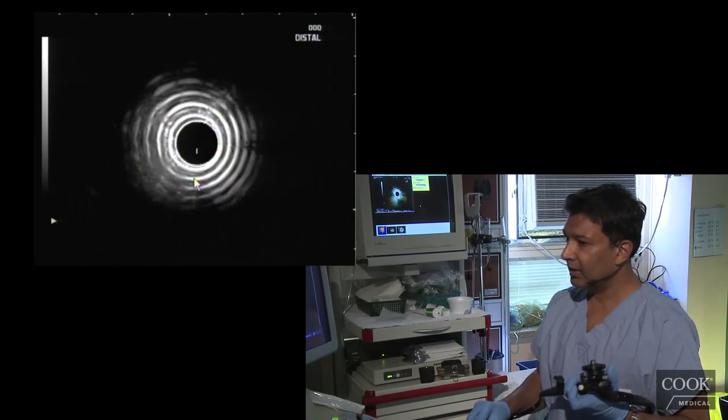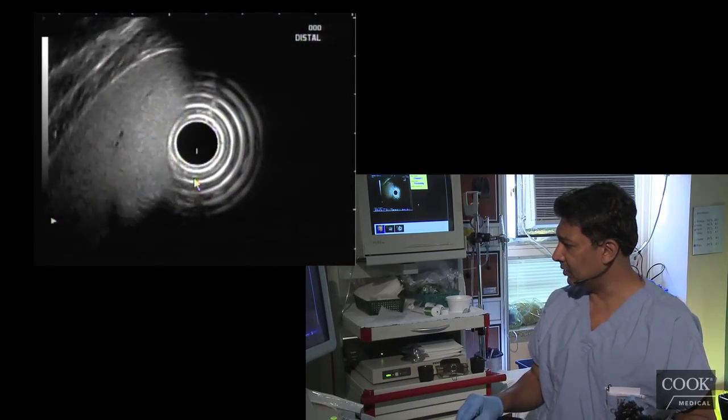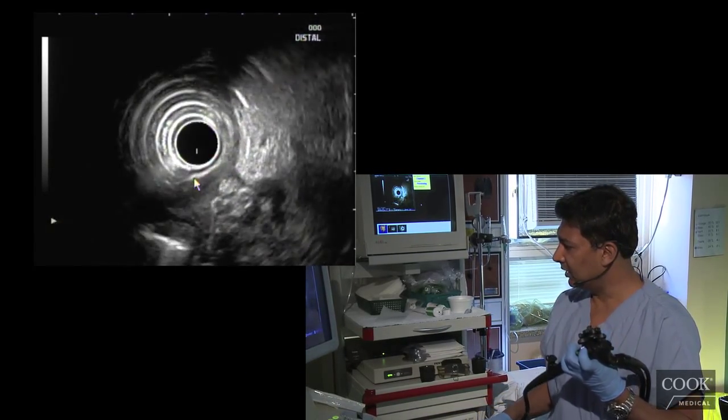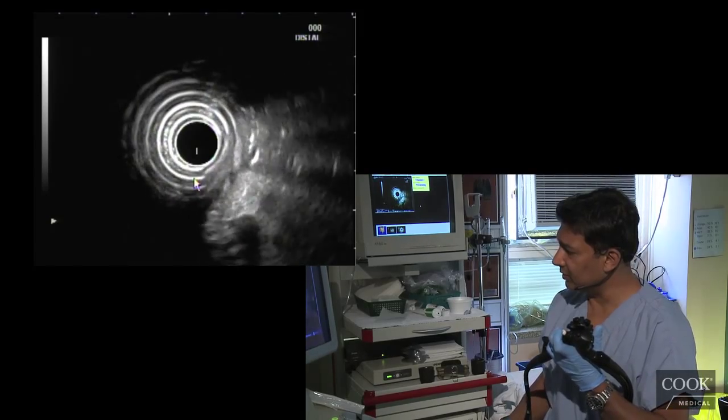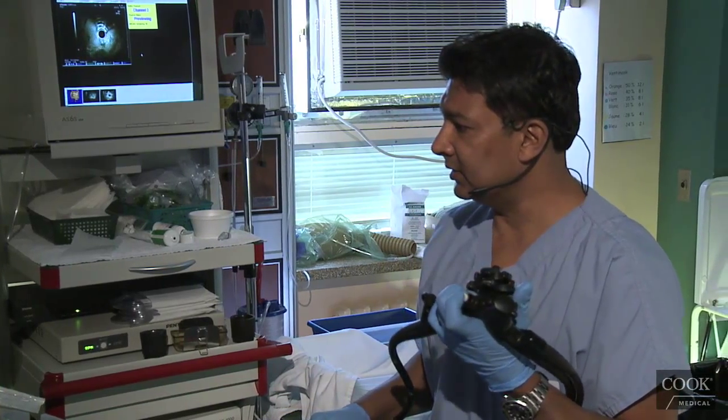Her gallbladder — I'm not going to worry too much about it, because I'm sure it's normal, and I'm sure they saw it on the regular ultrasound as well. She's a little uncomfortable, so I think we're going to stop here. So basically: chronic pancreatitis, collections, and a nice bile duct — and that's it.